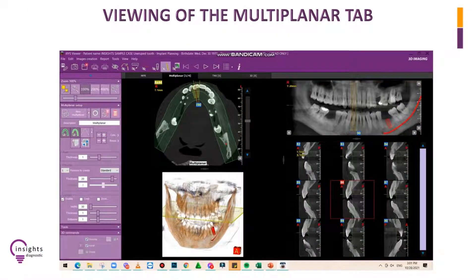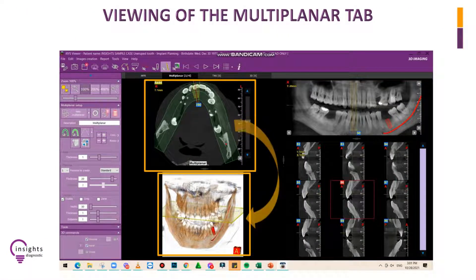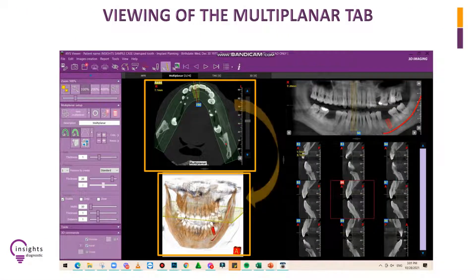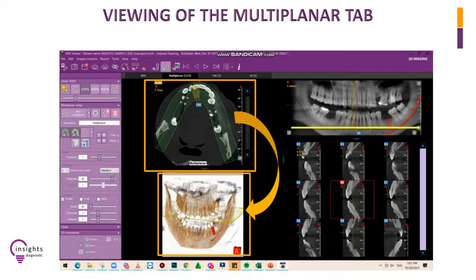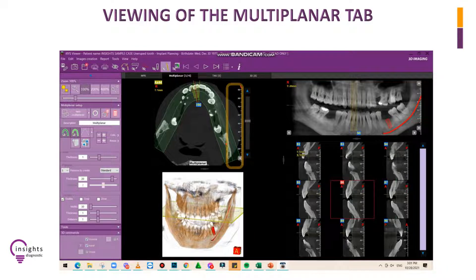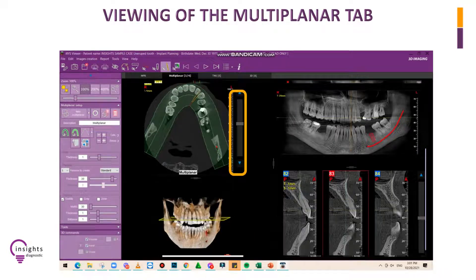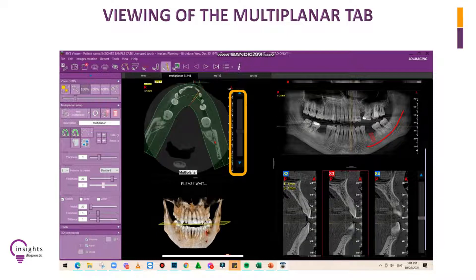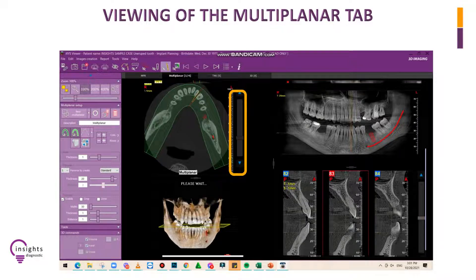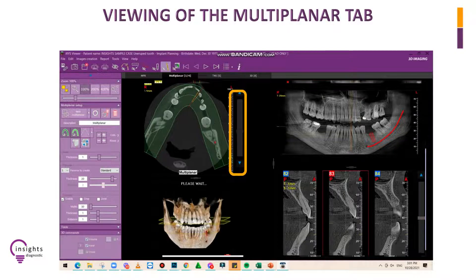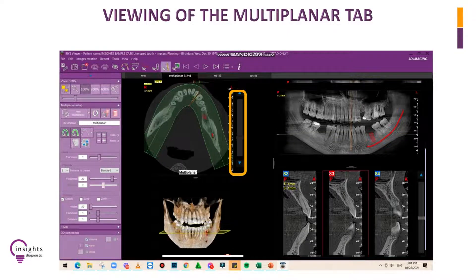There are other references aside from the yellow plane in the 3D model. The yellow horizontal line in the panoramic view is another reference of the axial view. Notice that when you scroll the bar at the right side of the axial window, you will also see the yellow plane in the 3D model and the yellow horizontal line in the panoramic view, following the movement of your axial slices as you move up and down.